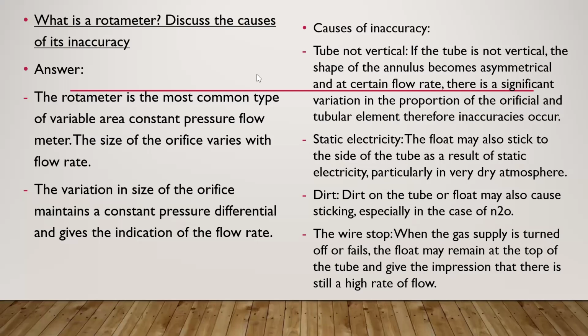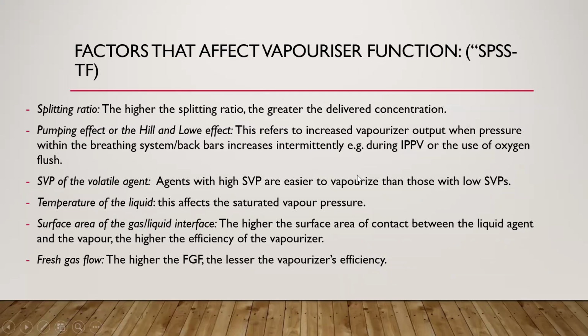Okay, now this is another question. What is a rotameter? Discuss the causes of its inaccuracy. Let me allow somebody to just quickly go through this. Quickly, anyone, what is it called? A rotameter. What are the causes of inaccuracy of a rotameter? Quickly, anyone, run through it.